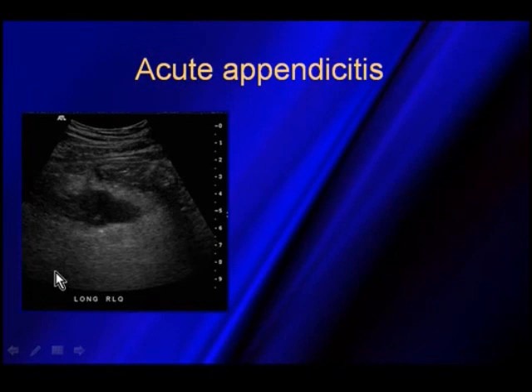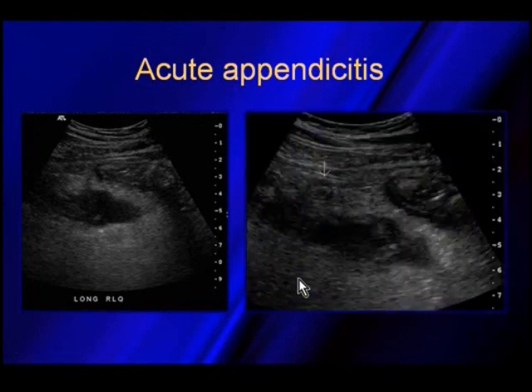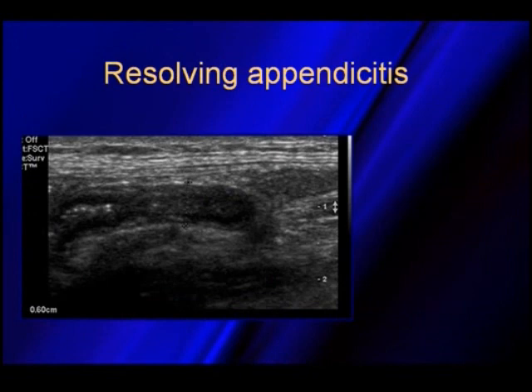There's a lot of different inflammatory processes that can cause this thyroid in the belly type of appearance. But in scanning around, what we're able to do is find what appeared to be a normal appendix. And this is an appendix that has perforated and compressed, and then we have this big phlegmon, or this fluid collection deep in the right lower quadrant. So what will happen is once the appendix ruptures and all of the fluid or the inflammation is outside of it, it will decompress and a lot of times return back to what appears almost to be a normal size.